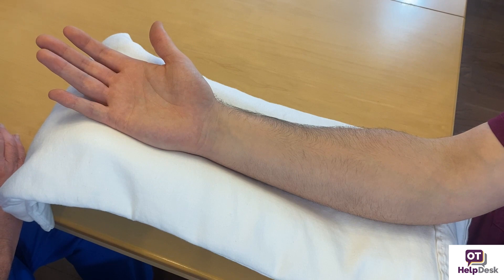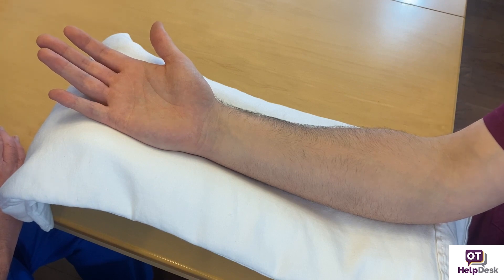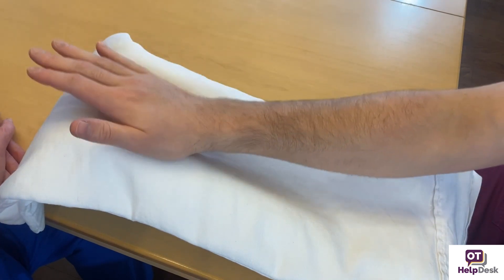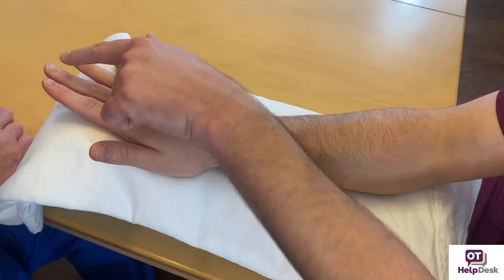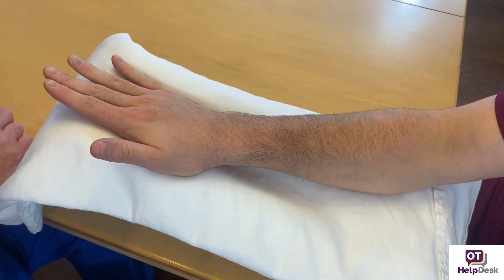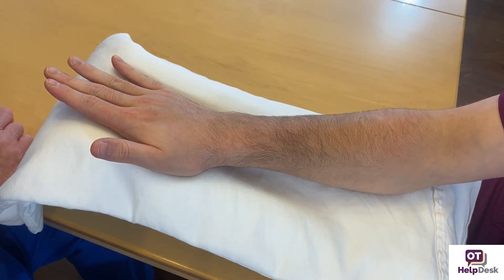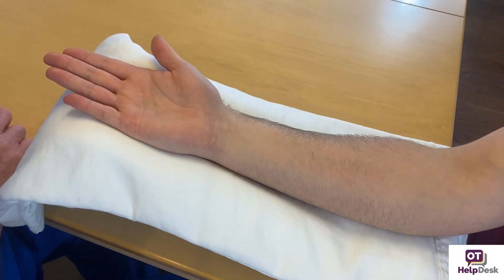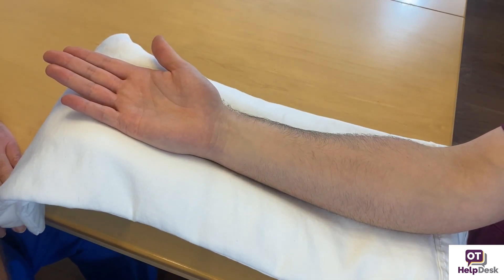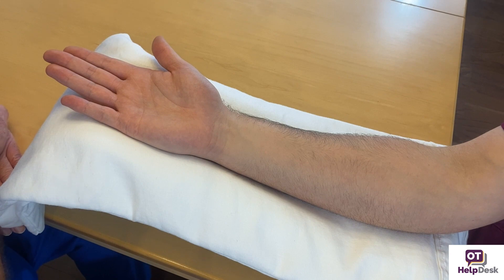For clarification, the only time you would not test the fingertips is when you're looking at the radial side of the hand — because if you test the fingertips there, you're not going to be getting the radial nerve. Nice call, Joseph.